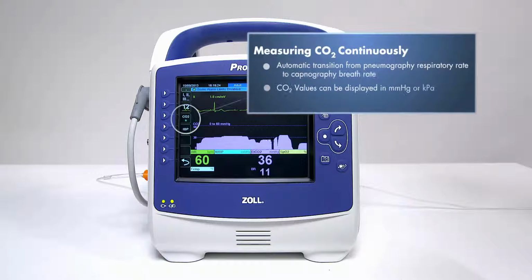Press the CO2 key to activate or deactivate capnography. As soon as capnography is activated, the capnographic waveform automatically appears on the screen. Respirations, which are measured through changes in thoracic impedance, automatically transition from impedance pneumography to capnography measurement. CO2 values can be displayed in millimeters of mercury or kilopascals.